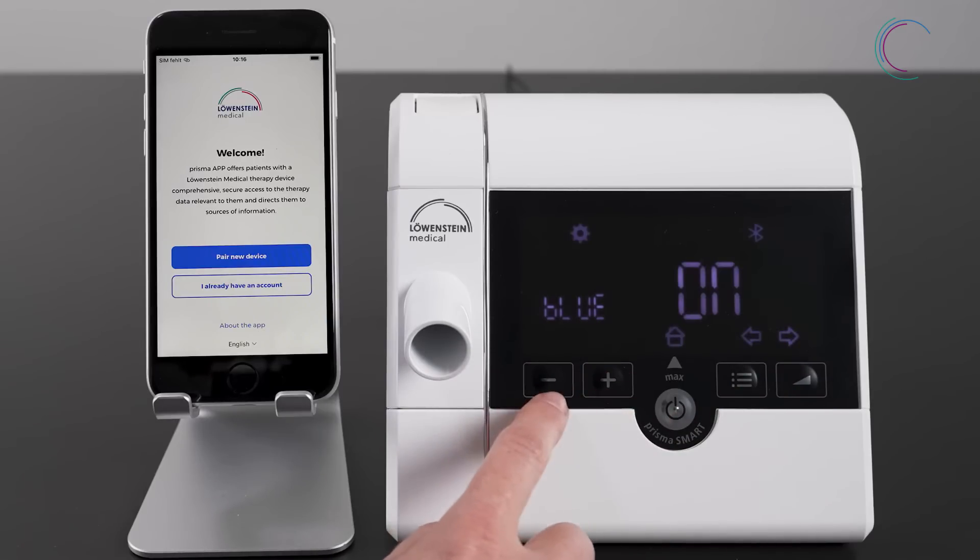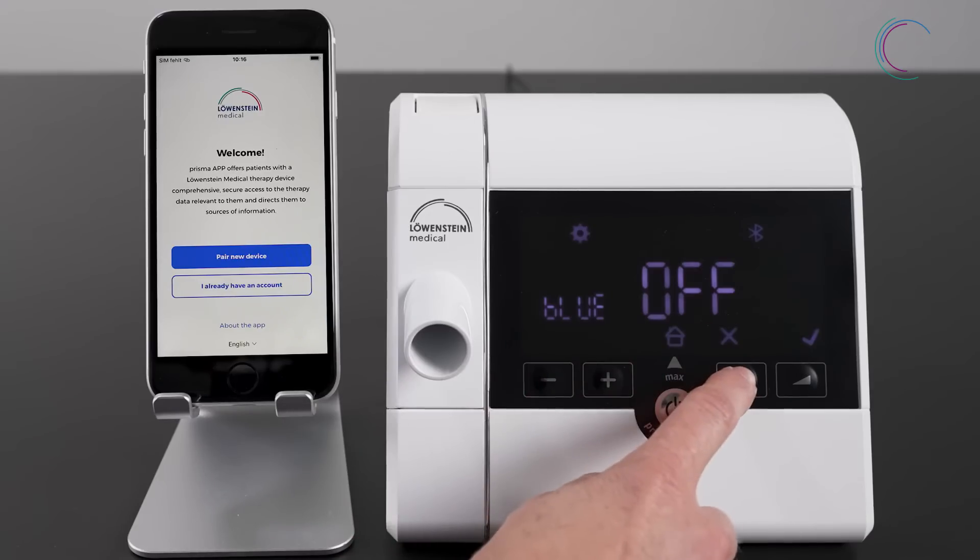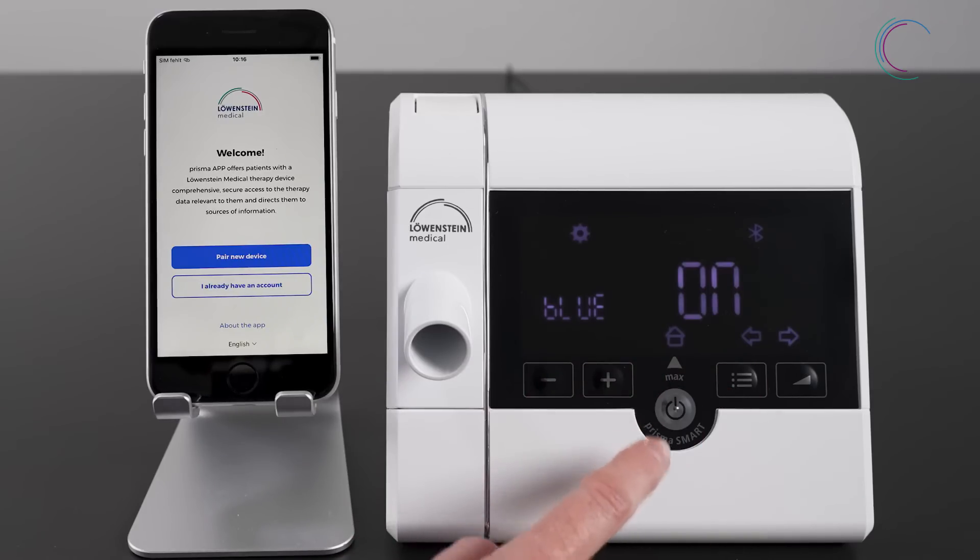By pressing plus and minus, you can activate or deactivate Bluetooth. Make sure that Bluetooth is on and activated.